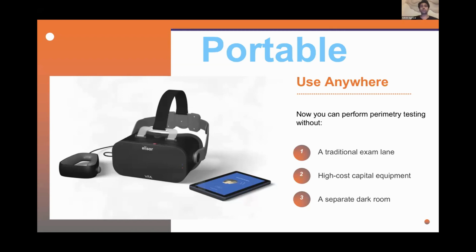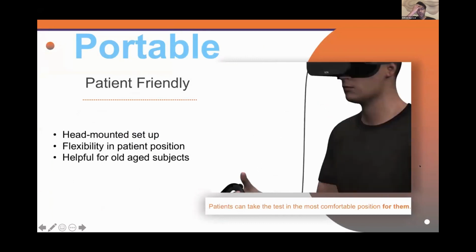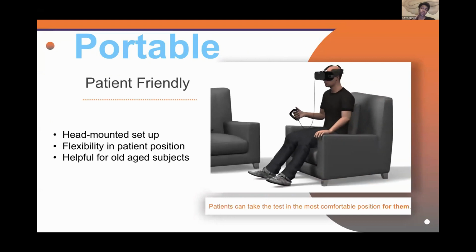So portable does not mean just out of the clinic. It means even in your clinic, it's portable. Next up, I think it's a head-mounted device. It's flexible, so you actually can make the patient sit down on a sofa. I've put a Lazy Boy in my clinic, so it really becomes easy for that patient. Old patients and pediatric age groups are really finding a little more comfort with this device.